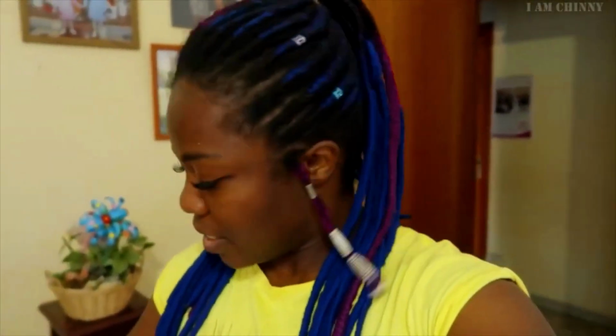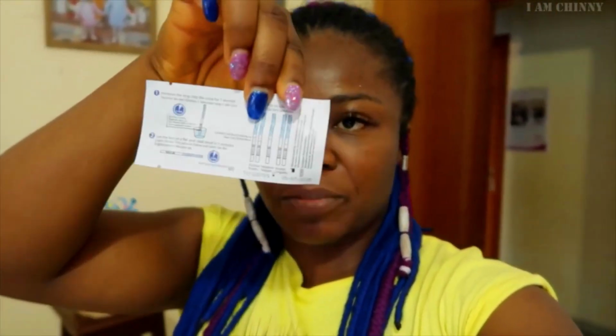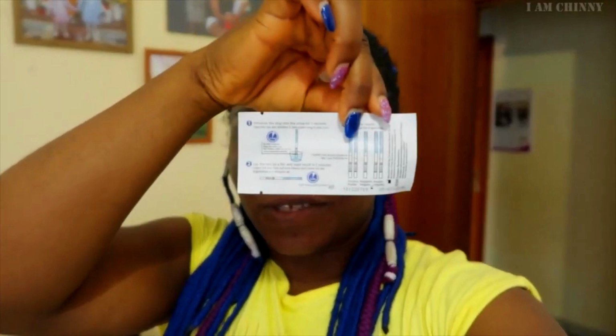But anyway guys, let me go get the pregnancy test that I already have at home, because I use it at home to confirm first before going to the hospital. A few minutes later. So guys, over here I have this. Let me show you guys. I have this pregnancy test at home. I have it a lot. I bought the carton. That's what I've been using for years. A lot of you know how to use it. When it shows 2 lines, that means it's positive. When it shows 1 line, that means it's negative. Over here I have my plastic cup because I'm going to the toilet now to pee inside the plastic cup.